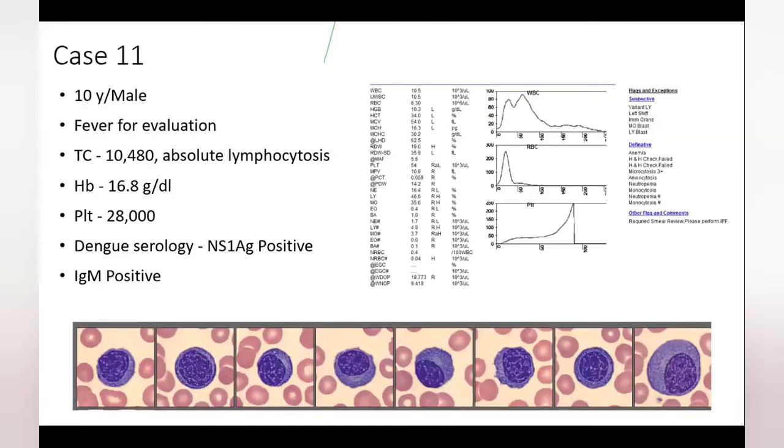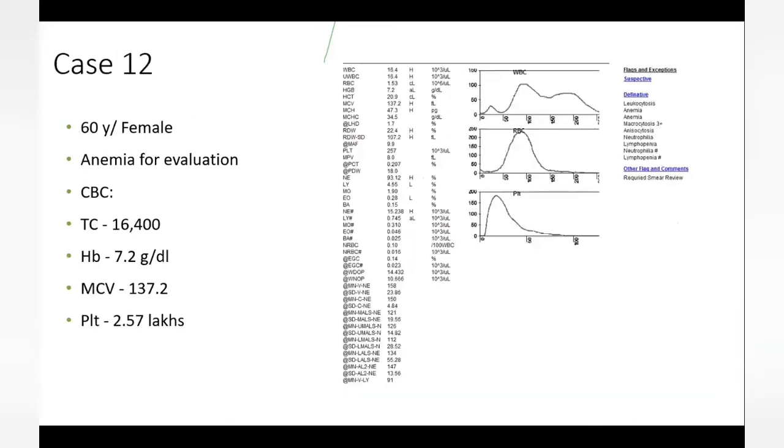Just to give you an example of how a different viral infection like our friend dengue with NS1 antigen positive looks like on the digital analyzer.